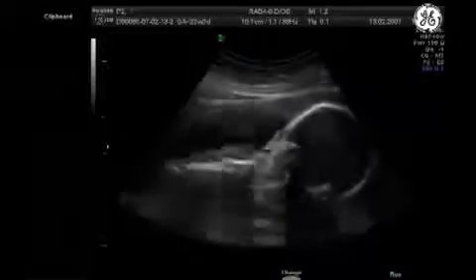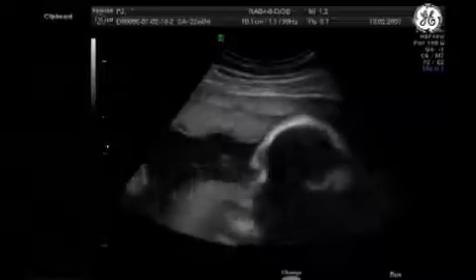Okay. And sometimes you start the examination, don't try to do a 3D when you start. The only thing you have to do is to do your 2D examination, and during your 20 minutes of 2D examination, the baby will move and turn. Because sometimes if you want, you will spend too long time to try to obtain the baby face.